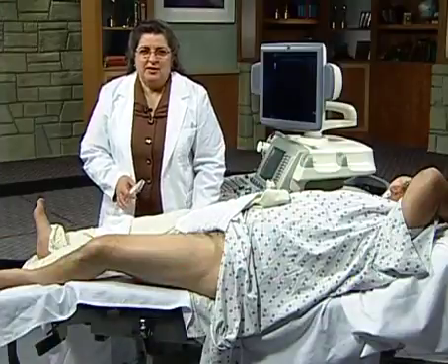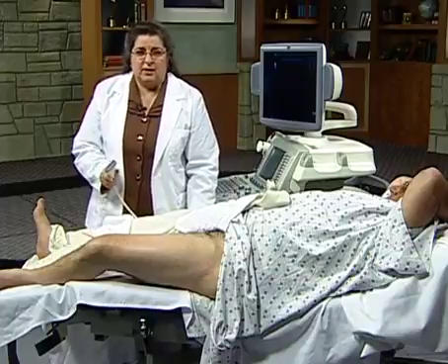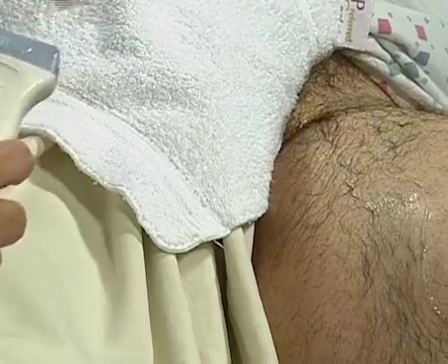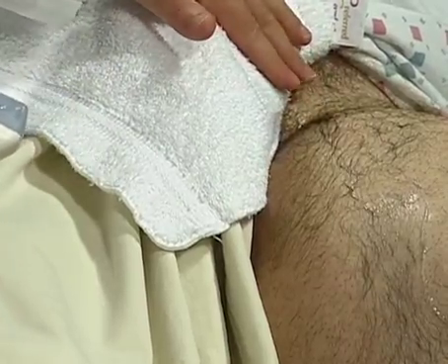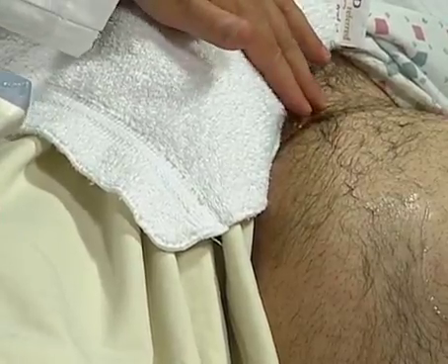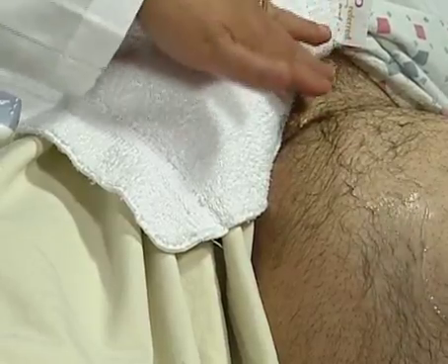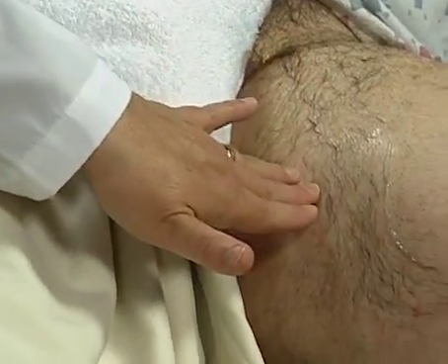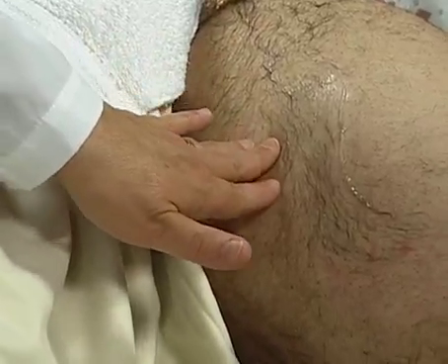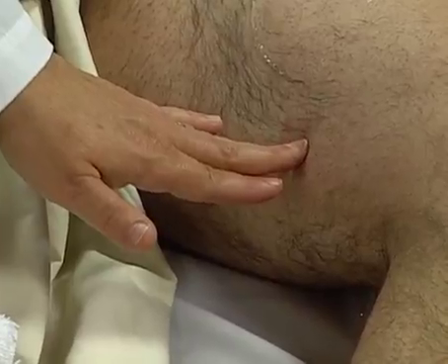Hello. Now I'm going to demonstrate an arterial duplex ultrasound exam of the lower extremity native vessels. We're going to start here at the inguinal ligament, or actually just below the inguinal ligament, the groin crease here, where we can see the common femoral artery. We have the leg externally rotated so we can open up the medial aspect of the thigh here. We'll follow down along the superficial femoral artery, continuing on down to the lower thigh.